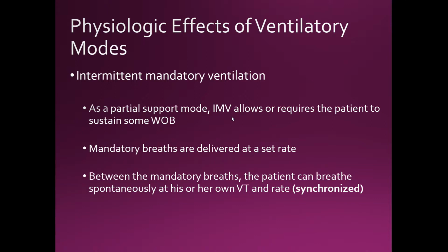And since we stick the majority of the patients on assist control and we drop them down to SIMV, that's why we call SIMV a weaning mode. I want you guys to think that it depends on what mode we started the patient on.